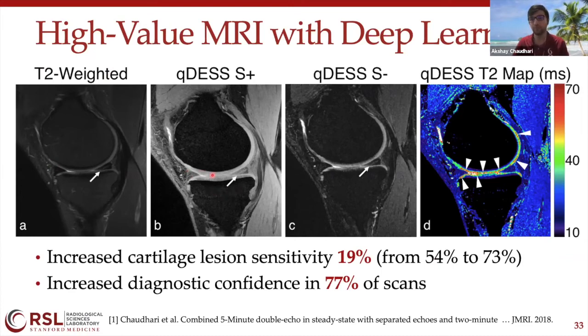The standard for measurement of cartilage thickness is a DESS scan, but there's a different variation of DESS that's used. Typically in qDESS, we're seeing these two different echoes, but the traditional and gold standard measurement for quantification of cartilage thickness is another pulse sequence which simply combines both of these echoes. It just adds them up together. So we're basically seeing the full thickness of cartilage with these two scans. So perhaps that's one reason why we're seeing a different contrast between these two images.